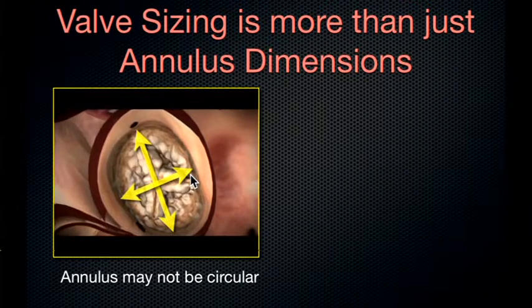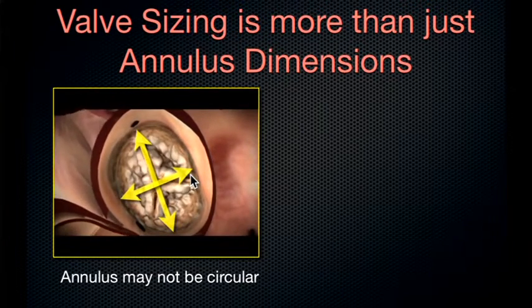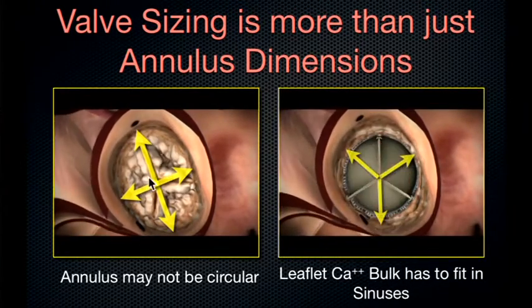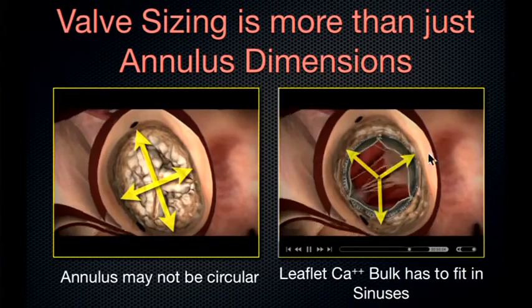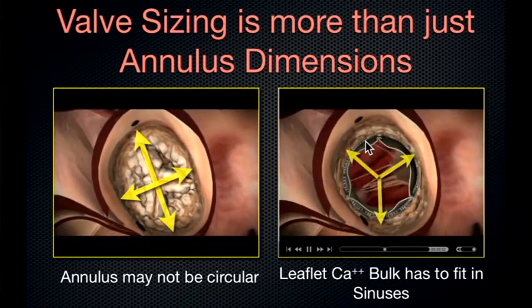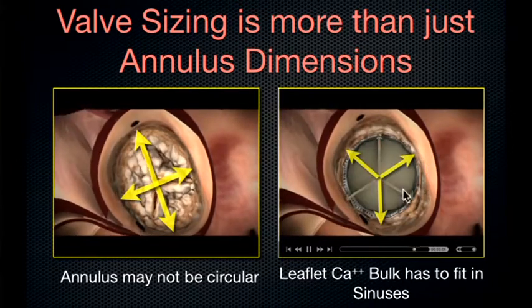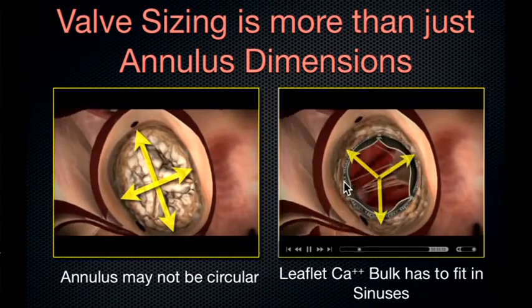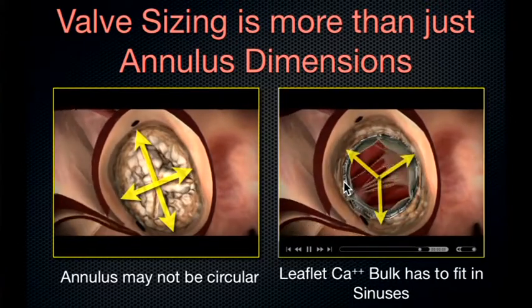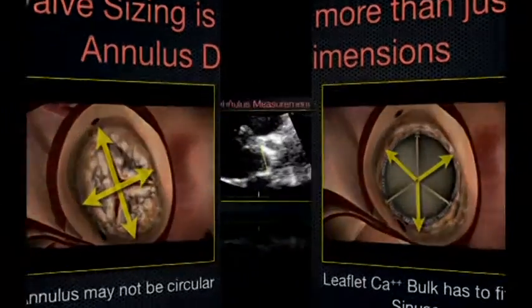The other important consideration, which is very well evaluated by echocardiography, is that we have to remember that the bulk of calcium on the leaflets here has to fit into the sinuses when it's displaced by the implanted valve. So the valve is going to push the leaflets back, and we need to make sure that there's enough room for those leaflets, and in addition that they'll provide enough support for the valve as well.